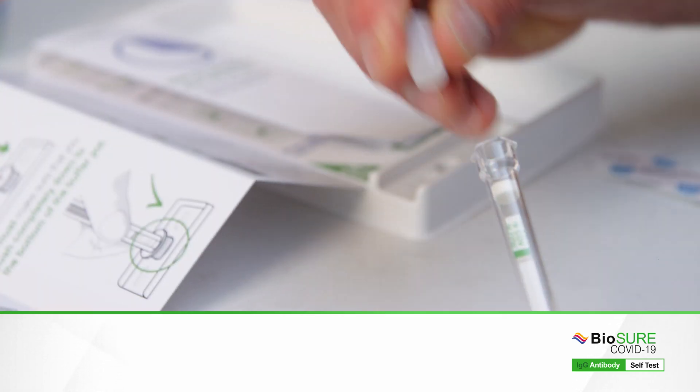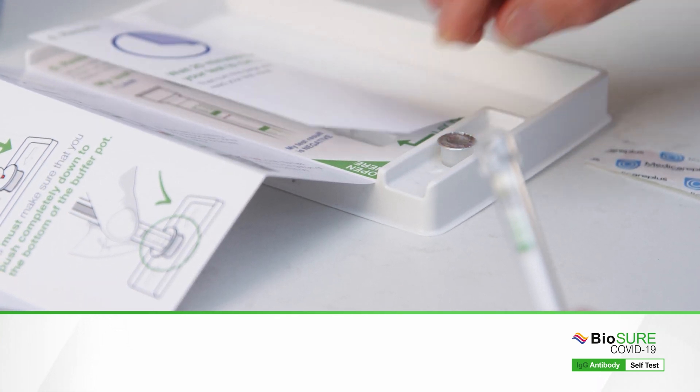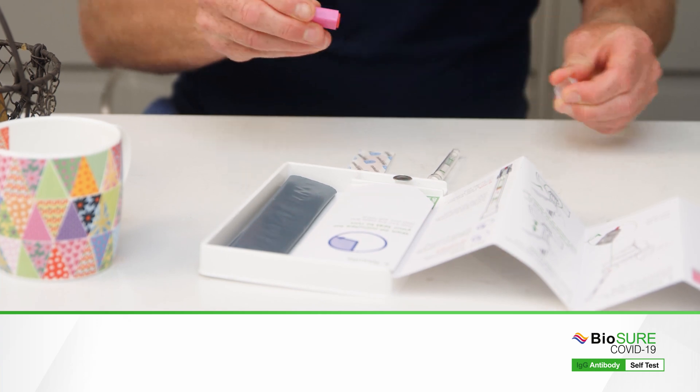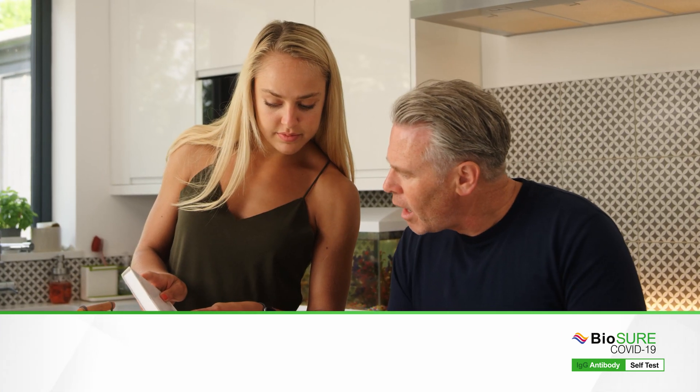Remove the buffer pot from the top of your testing device and place it in the hole in the tray. Now take the lancet and carefully remove the plastic cap. Remember, this will only work once.